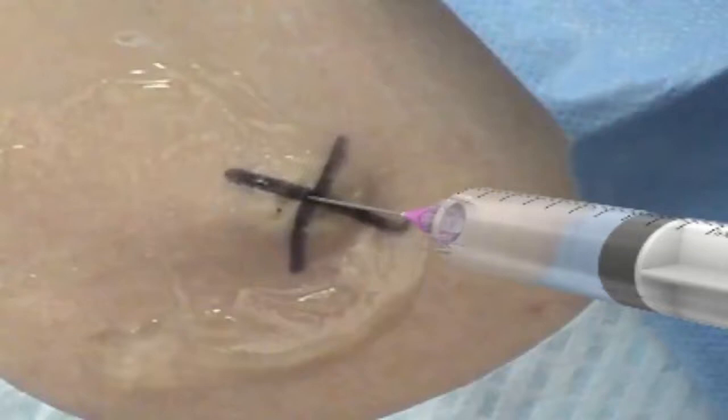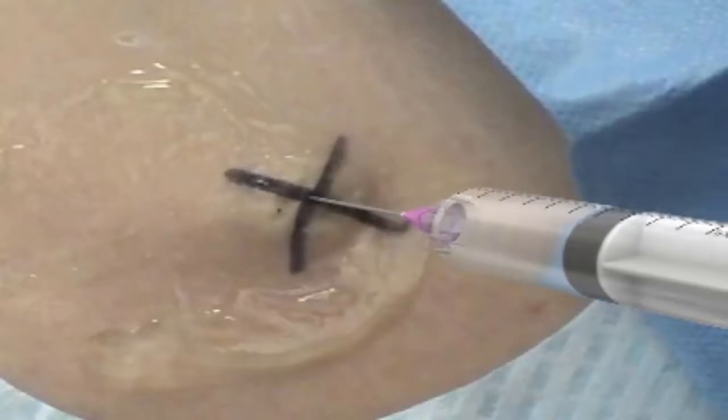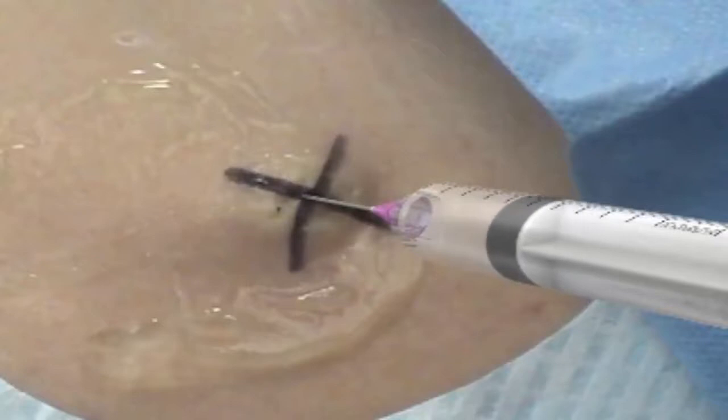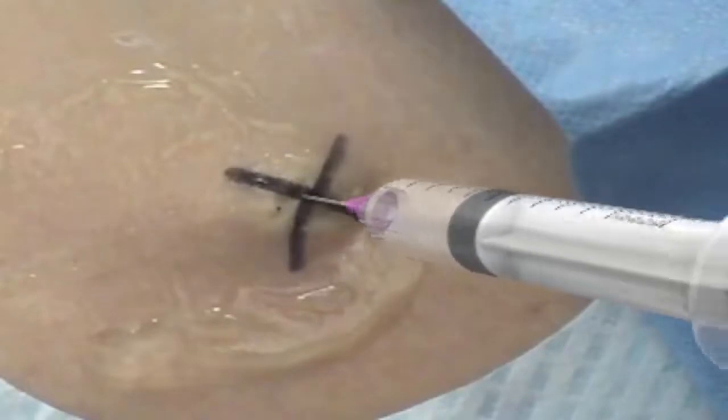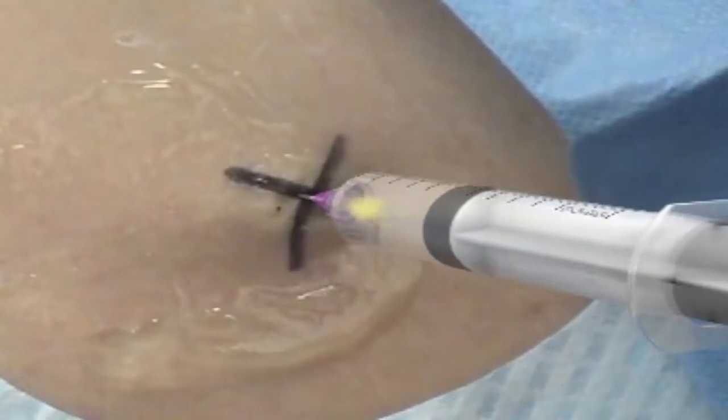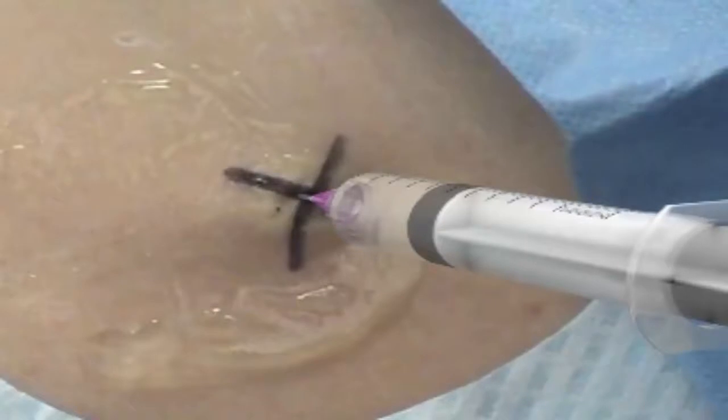Continue to anesthetize the deeper tissues in the anticipated tract of the paracentesis catheter, intermittently pulling back on the syringe every 2 to 3 millimeters. Once peritoneal fluid begins to fill the syringe, inject additional anesthetic to anesthetize the highly sensitive parietal peritoneum. A total of 5 to 10 milliliters of lidocaine is generally used.